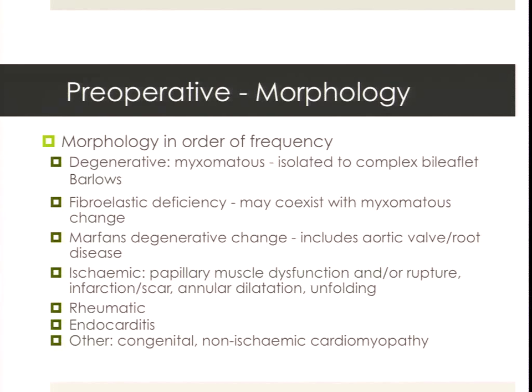Once we've looked at the morphology, they've got a lot of that from pre-op, but sometimes the quality of the images preoperatively isn't as good as what we can get under GA, where the patient's flat out rather than fighting against the TOE probe, with the poor cardiologist up in the room where we're underdosing them on various things.